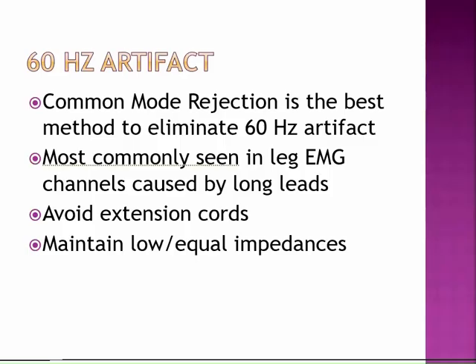So whenever possible, avoid extension cords. We try to keep our cables as short as possible, but obviously we need to give the patient room to move. And whenever possible, make sure your impedances are low and equal. Oh, there it is again, and I think that's the 7th time I've said it. So if you haven't taken a note at this point, you might want to take that note.